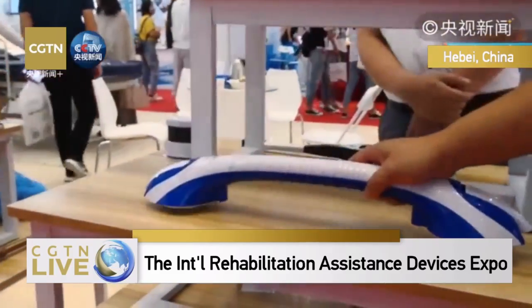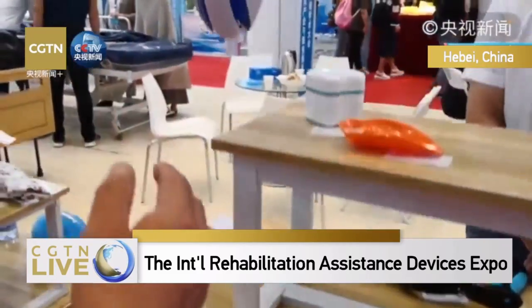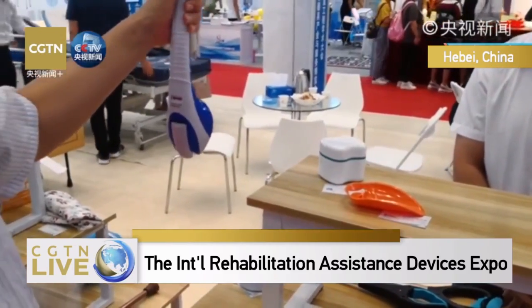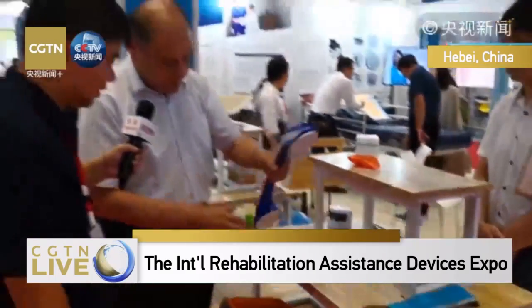This is a handbar that can be attached to the furniture. When there is no handle, you can use this to make a handle.